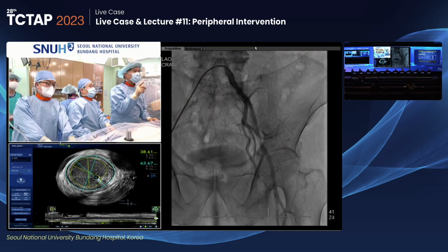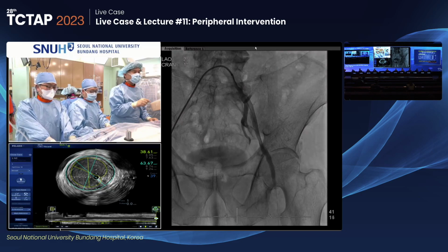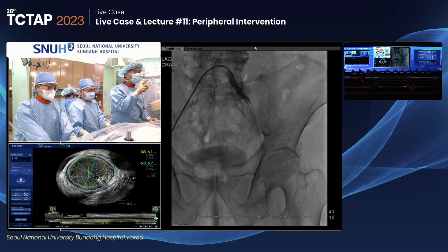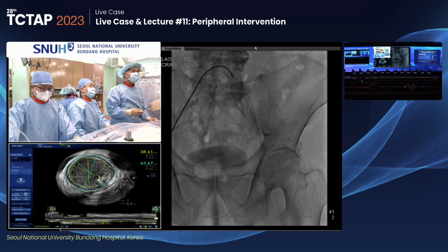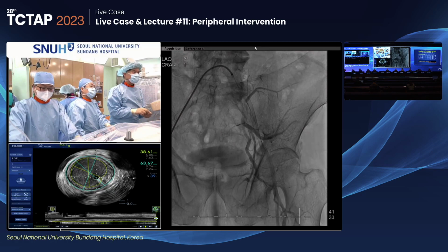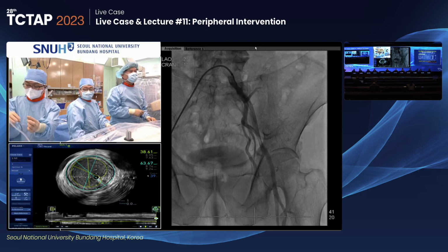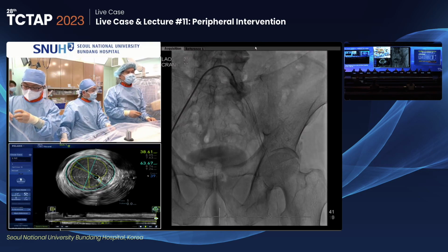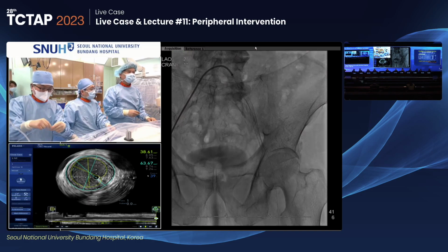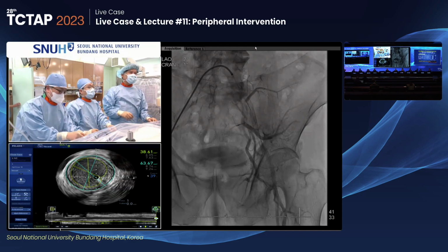And unlike the coronary work, I will use a smaller size of adjuvant balloon, 8 millimeter distally, because we should always be very cautious in iliac injury, not to make a perforation. Absolutely. You don't want to ruin this case by rupturing the external iliac with the adjuvant balloon. Yes. Yeah, no, that's a great case. You can change it to another one. Thank you, Dr. Ra. I will finalize with just modification optimally.